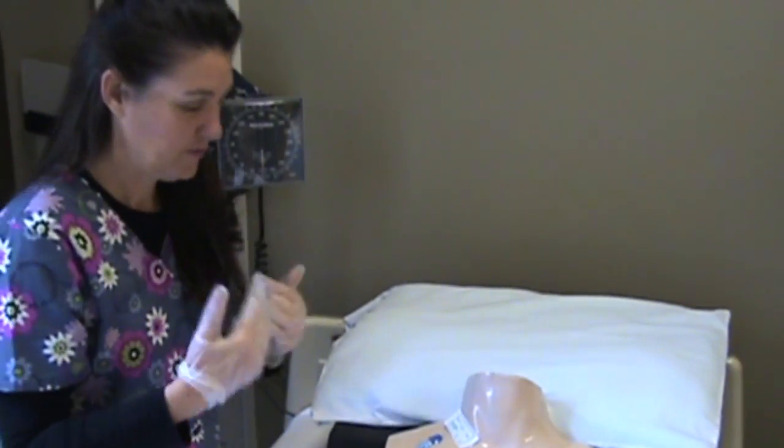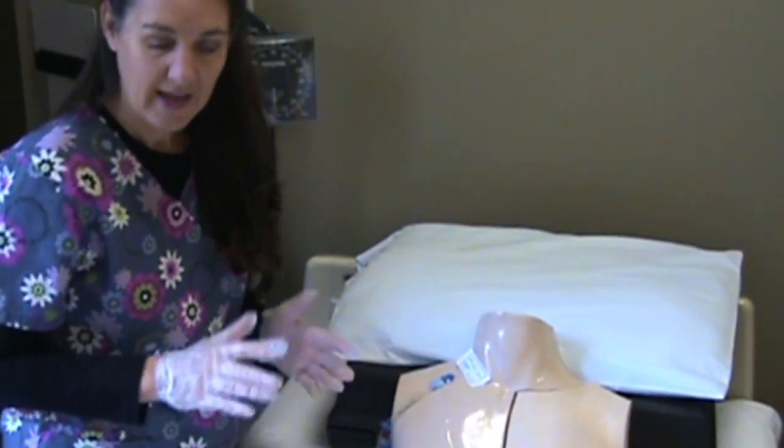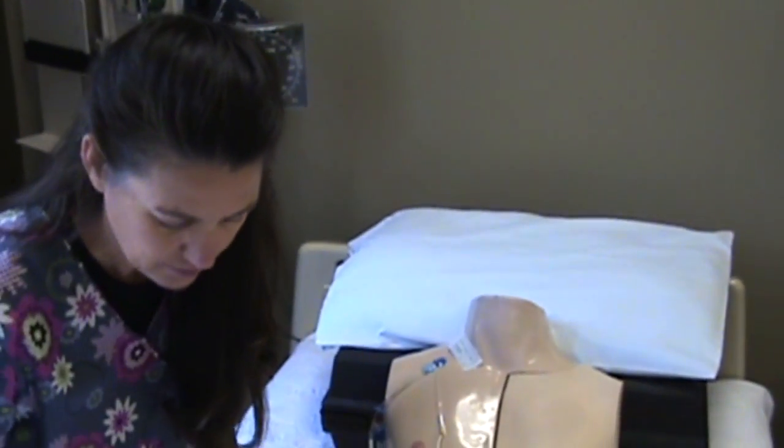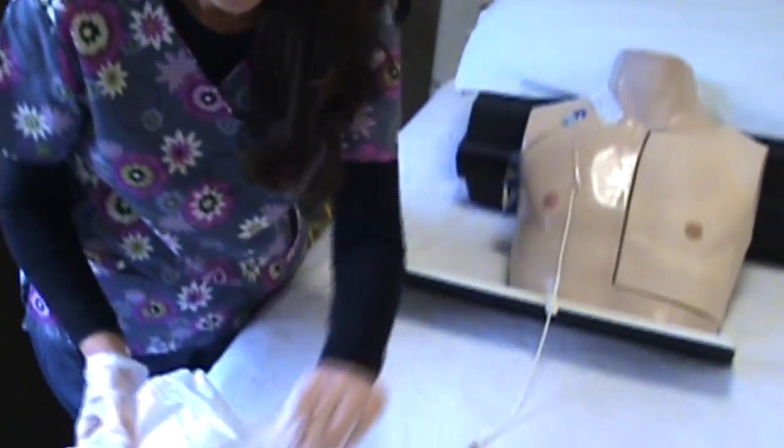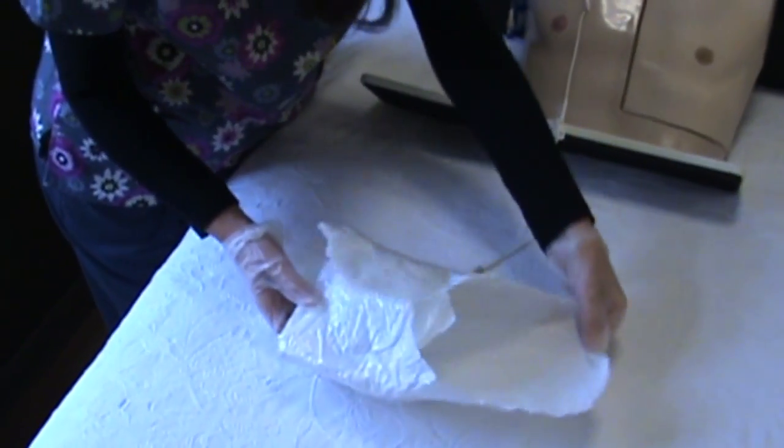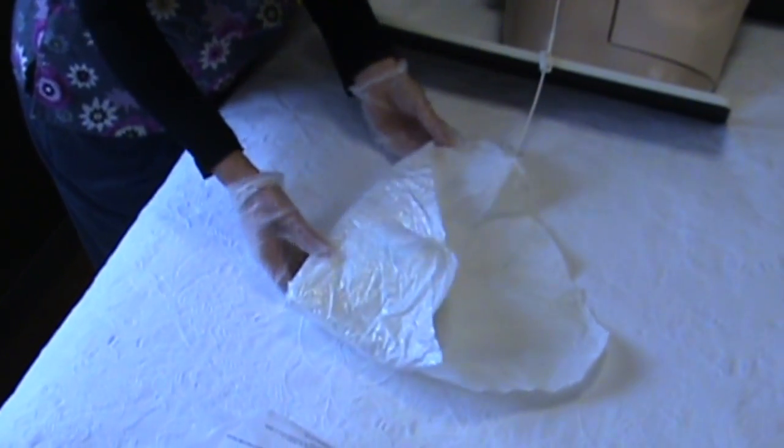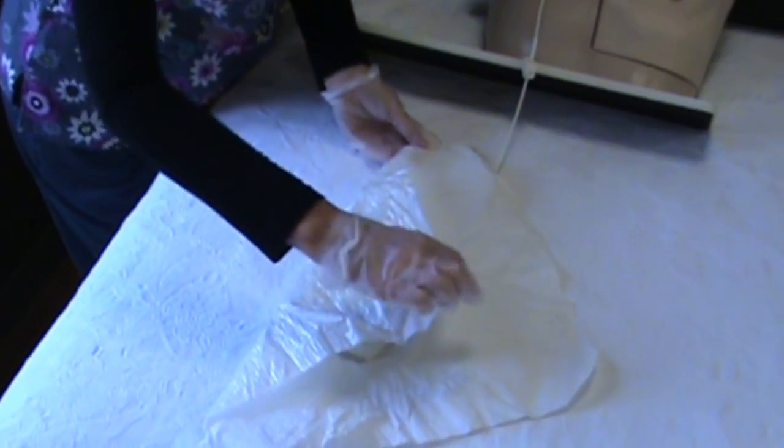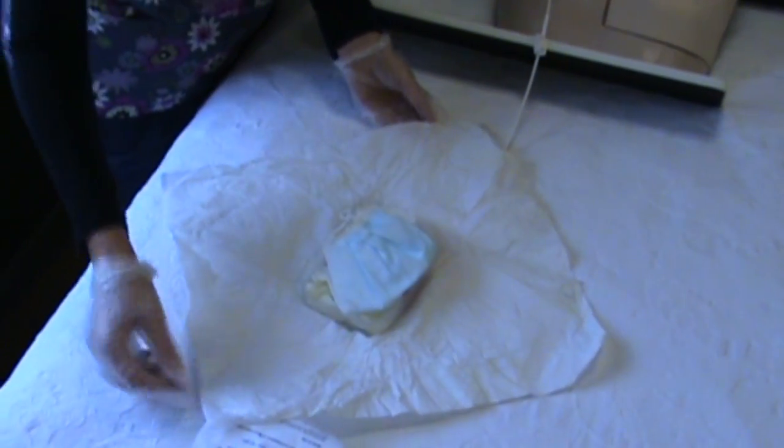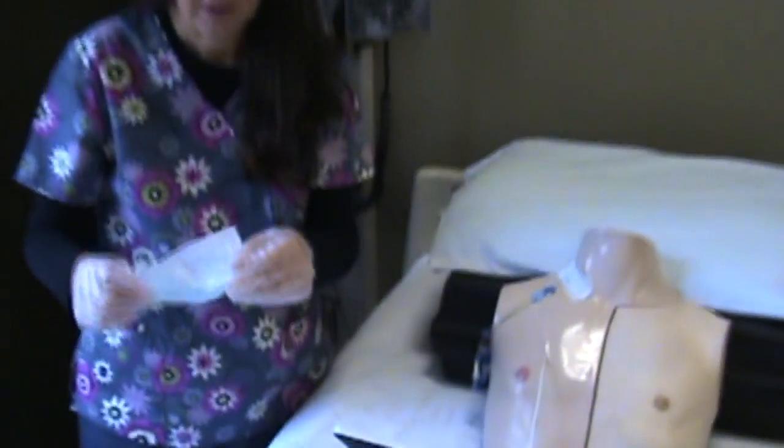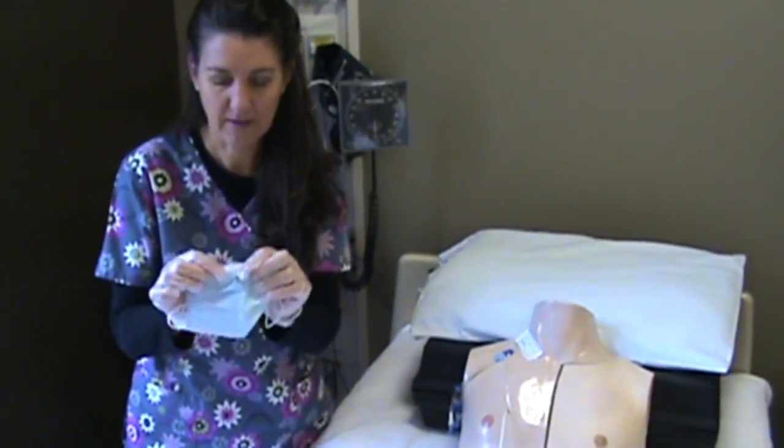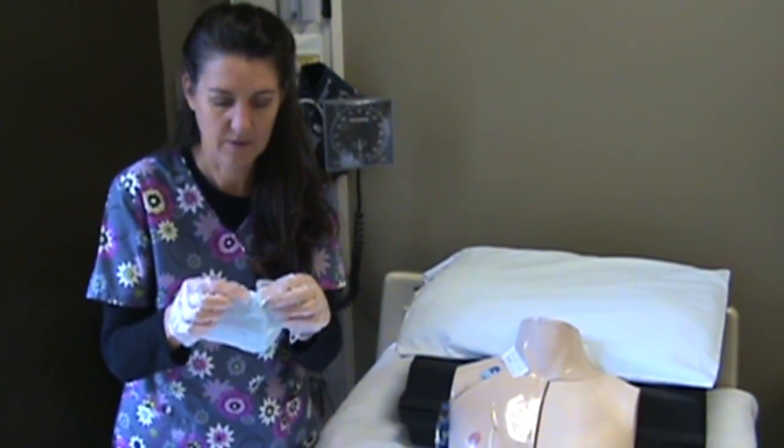I also need to put a mask on myself to protect them from my germs, and the mask is found in the kit. So I'll open the kit here and I'm going to open it away from me. The mask should be right on top. When you pick the mask up, it should have a little middle area right here, a little wiry area. Just put it around and then form that over your nose.